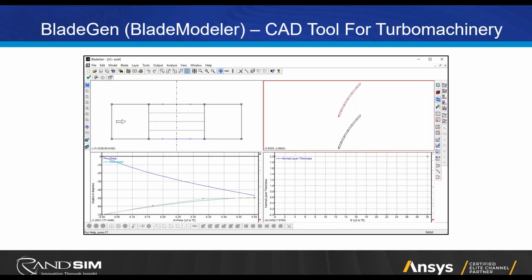Next slide, please. Okay, what we have here is a glimpse at the GUI for BladeGen, which is our CAD tool for Turbomachinery. The first thing you'll notice is it doesn't look like a traditional CAD tool. That's because Turbo blade designers do not use traditional CAD as a rule. They use some different views, developed views, which are basically meridional space, and you look at the theta, the angle, the amount of wrap in the blade. So it's a way to kind of untwist a blade, if you will.